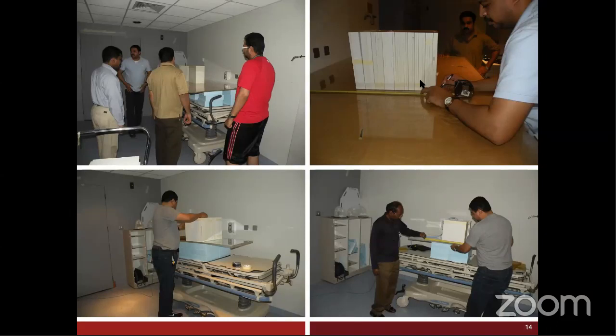I've tried to talk to our physicians about this issue and was suggesting, look, maybe you should lower your prescription, maybe to 190 or 180, so that at least we know the dose that the patient is going to receive is going to be plus or minus 10%. Now, 2 grays is actually our lower point.